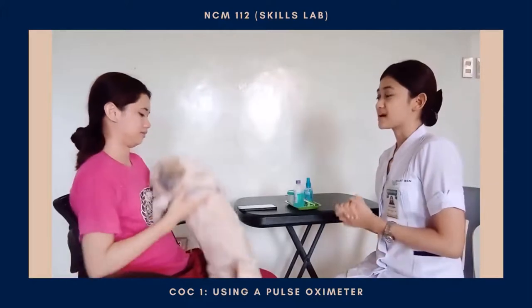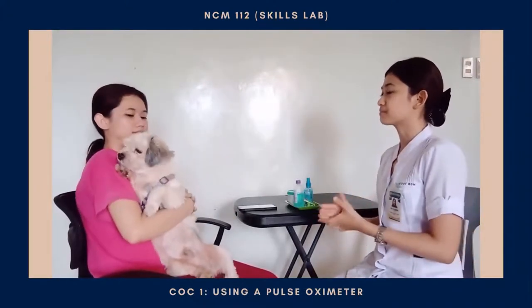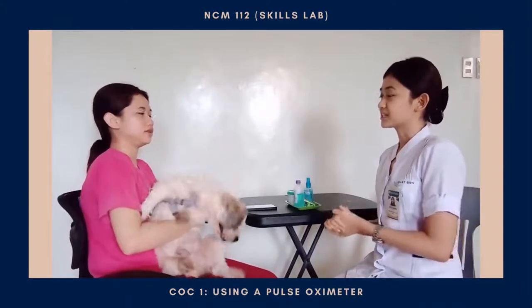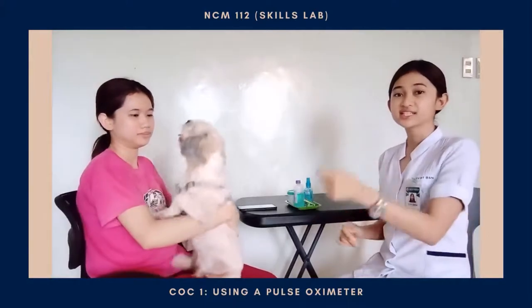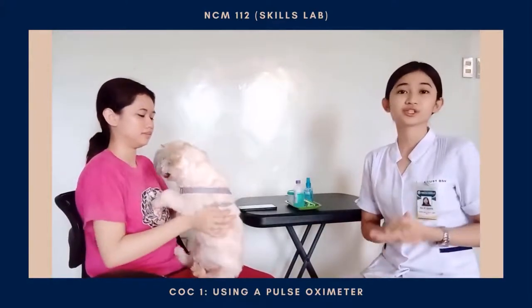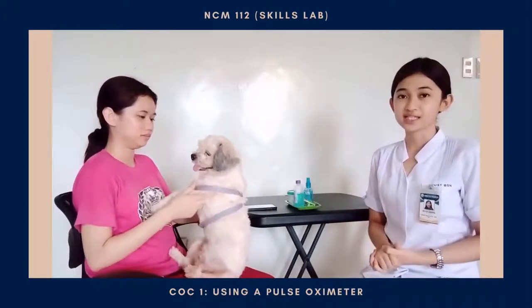Good day, ma'am. I am Hanz Nicole from the UST and I will be your student nurse for today. May I know your name, ma'am? Juni Cyrus. And your date of birth? December 1, 2020. Then, close the curtains around the bed and close the door to the room if possible. This will help us to provide privacy.